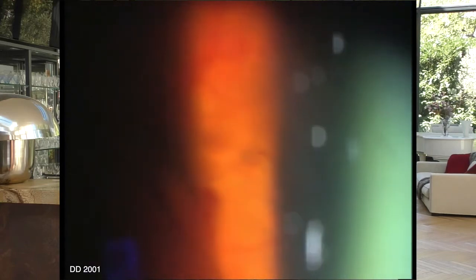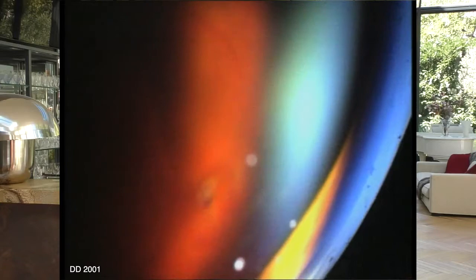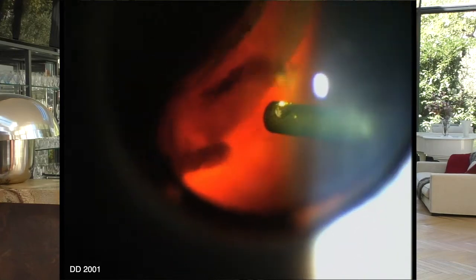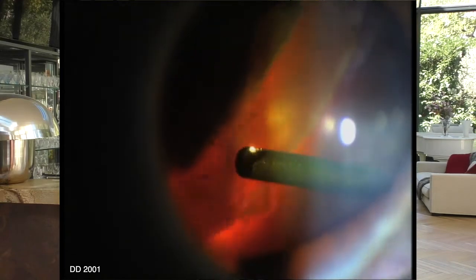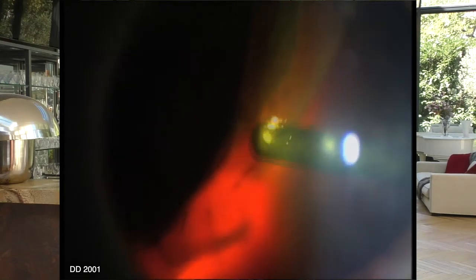Here is an example where the entire temporal side of the retina was very visible with a tear at 11 o'clock. The vitrectomy allowed me to discover a small nasal RD with another tear. Without a vitrectomy, the spontaneous evolution of this RD, considering the growth factors provided by the blood, would have been very severe.